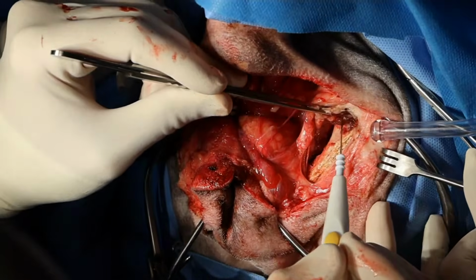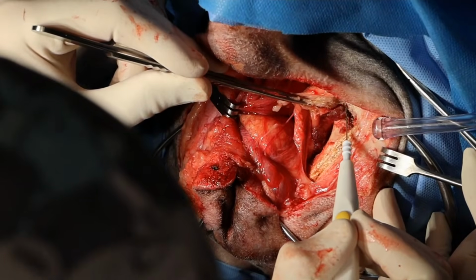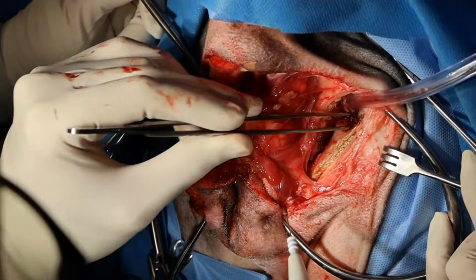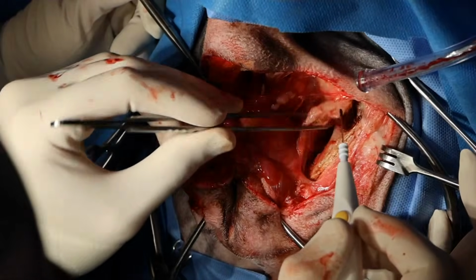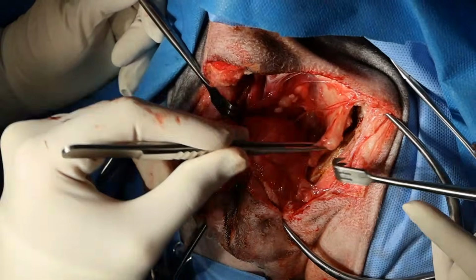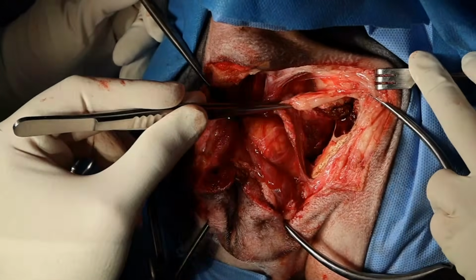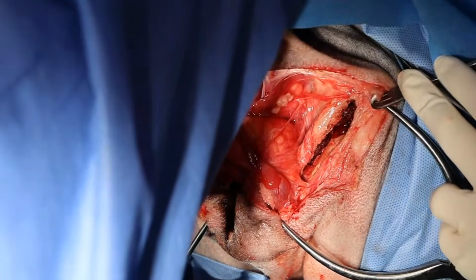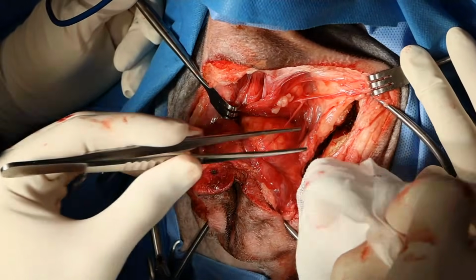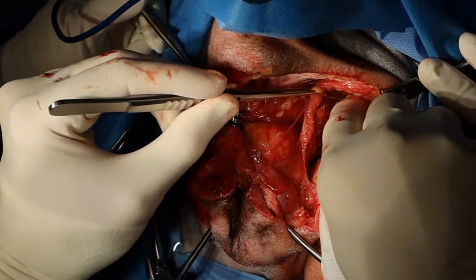Because I've heard stories of people inadvertently grabbing the sciatic nerve with a needle with suture, right? And that would be bad. All right, so now this is our internal obturator flap right here. Nice and dense. All right, so I'll start getting some suture material, please. And we're using 2-0 Prolene.